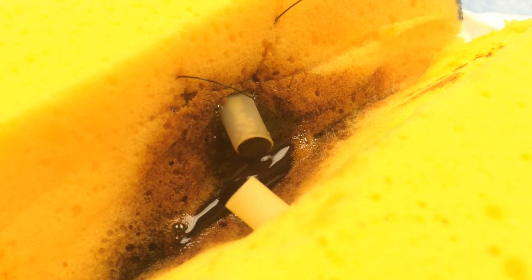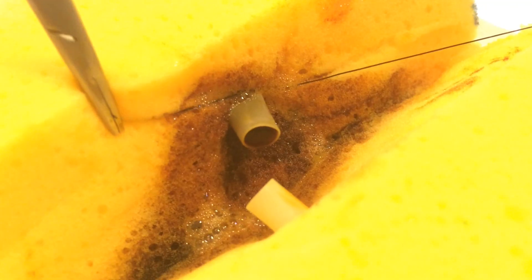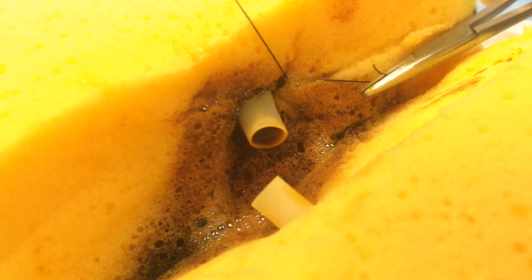When you tie off your knot, you'll create this figure of 8 pattern which extrinsically compresses the tissue surrounding the blood vessel. It's important to note that we're not actually tying off the blood vessel here, but rather creating an extrinsic compression around the blood vessel in order to achieve hemostasis.